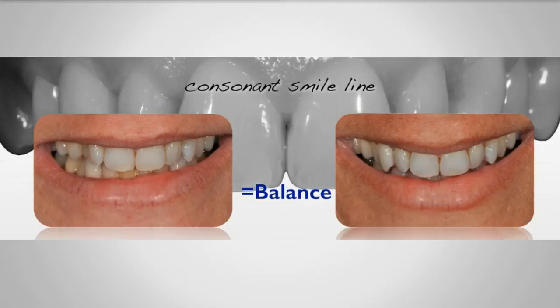All right, a couple more questions. Do you have any with ridge laps on the facial buccal? Gosh, when I first started doing implant dentistry, when we went through the cingulum, I had a few ridge laps, and they looked awful. That's why I asked for the PIE, palatal incisal edge. I don't want to go as far back as through the cingulum. That's when you end up with a ridge lap because the implant is too far from the facial contour. That's exactly right.